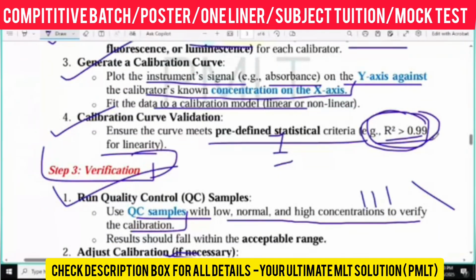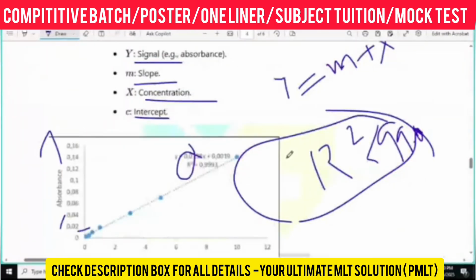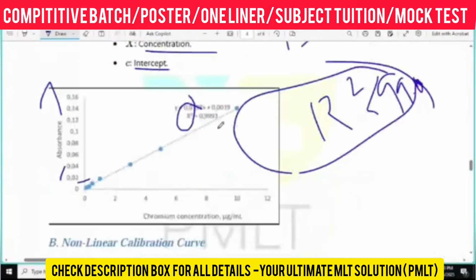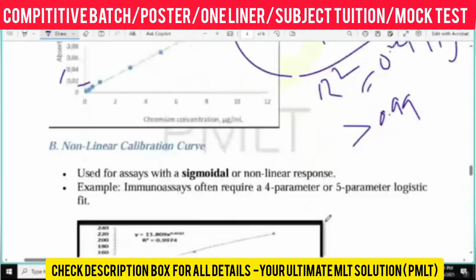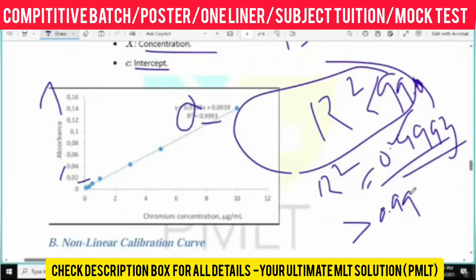R square should always be 0.99 or higher. Here R square is equal to 0.9993. Is it higher or lower than 0.99? Higher, right? This value is higher.